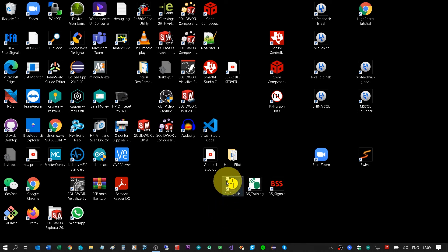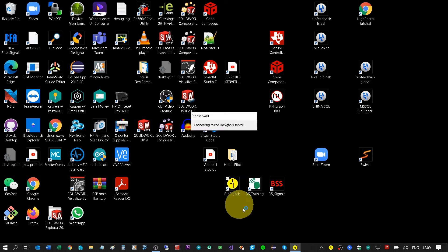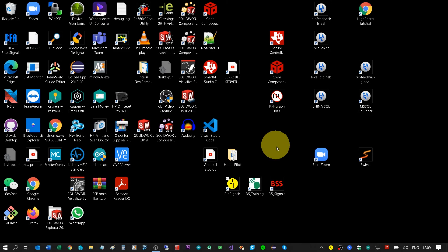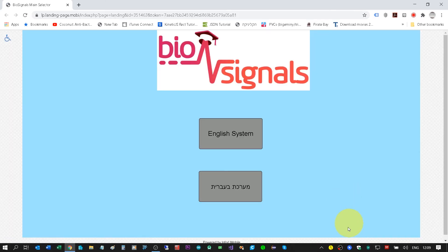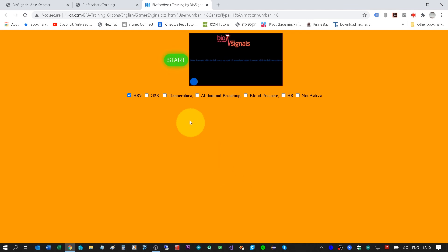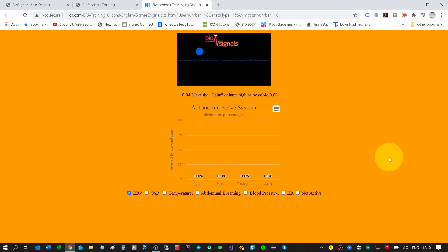Now let's go to the third application — the yellow circle icon with the name BioSignals. This application allows local training while transmitting all the signals and analysis to the cloud. I will double click the icon and get a small window to type in my email address and password — my registered credentials in the cloud.